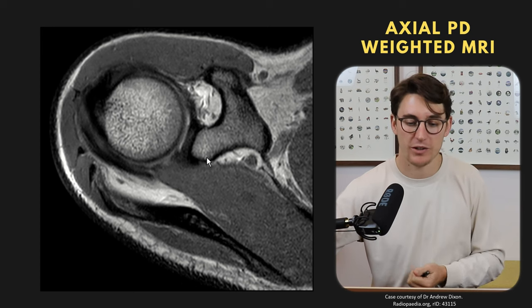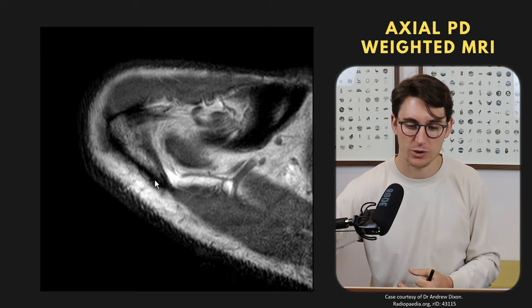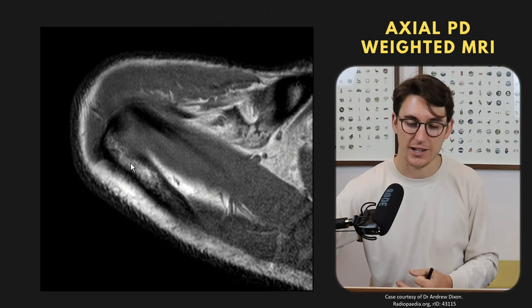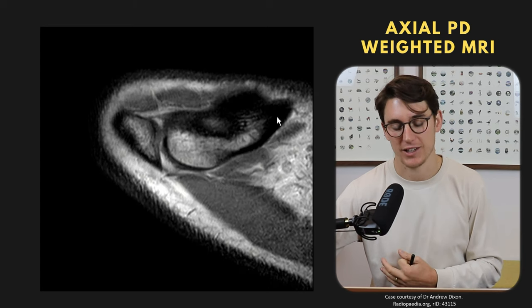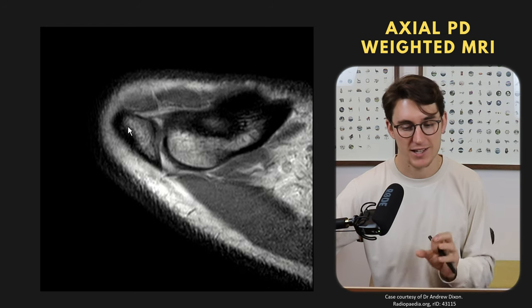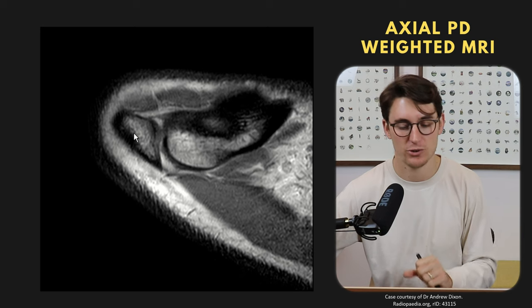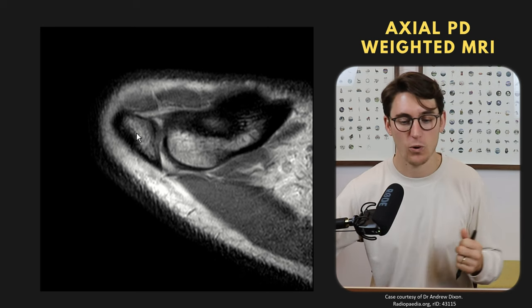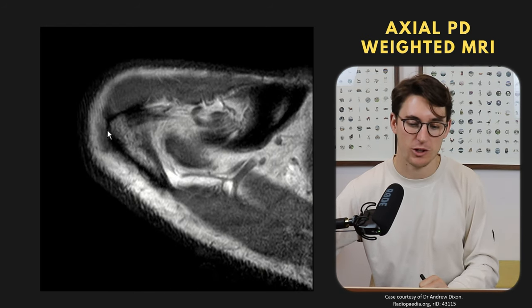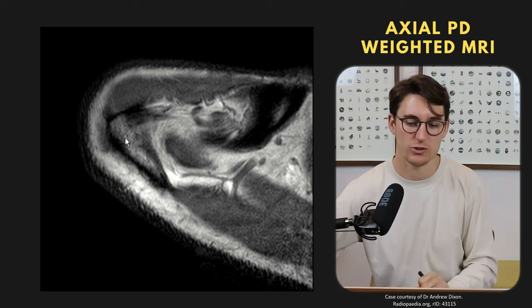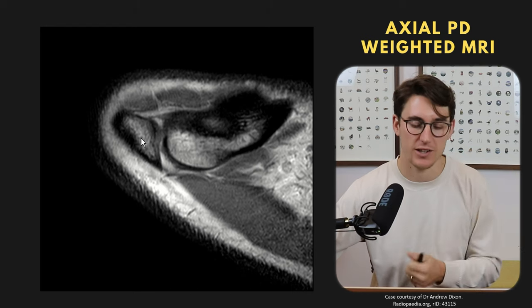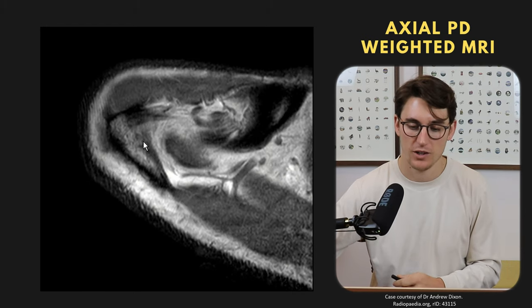Scrolling superiorly we should see the acromion come into view, coming back down to the spine of the scapula, and anteriorly articulating with the clavicle. Looking at the bones — sometimes we can have a separate os acromiale, a part of the acromion that has yet to fuse, either because we have a young patient or it's a normal anatomical variant. People with an os acromion can be more prone to impingement, so it's important to alert surgeons if present.